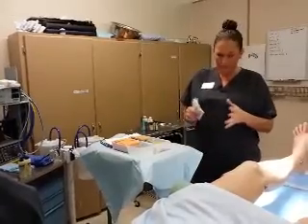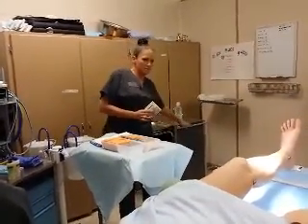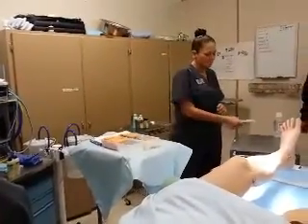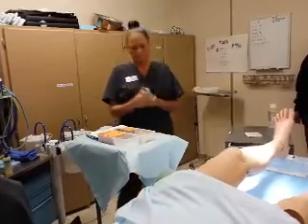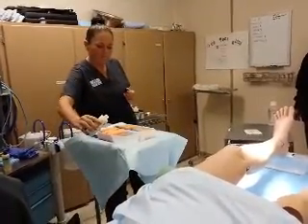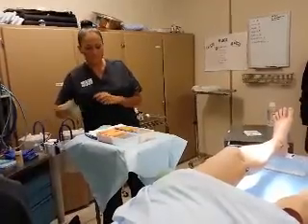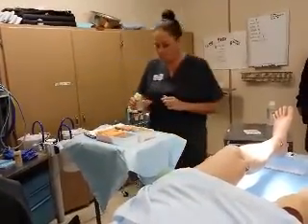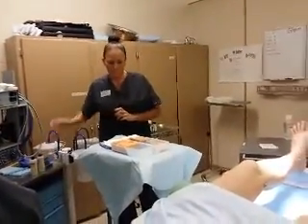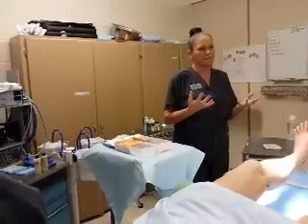So, I don't have another table handy. I can come down here if I need to. Or I could have stepped back if I've forgotten and bring something up. Because you're going to do open gloving technique, correct? Yes. I'm going to set my gloves there. This is my scrub. I'm not going to reach over, come around. Now I've got everything on there that I need. I've got my patient positioned. Next thing I've got to do is something sterile.